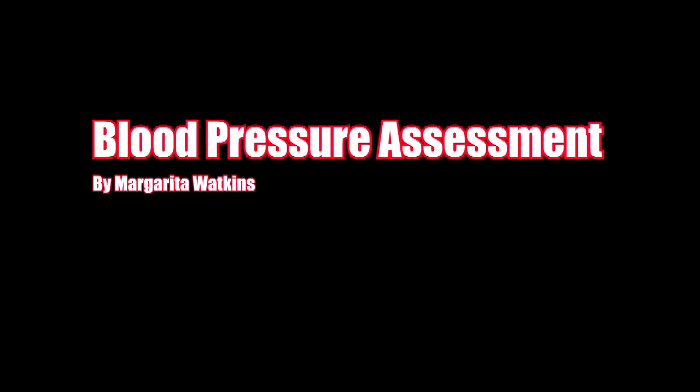Hello, my name is Margarita Watkins and I will be demonstrating how to assess resting blood pressure.